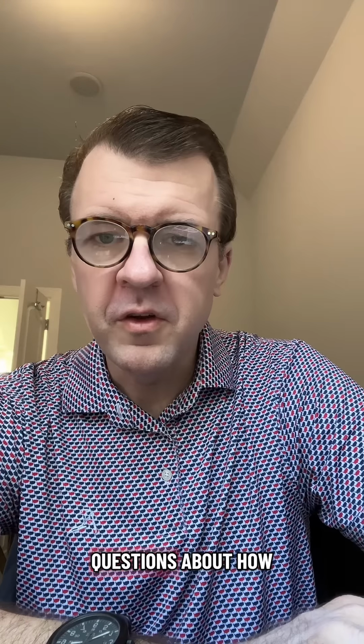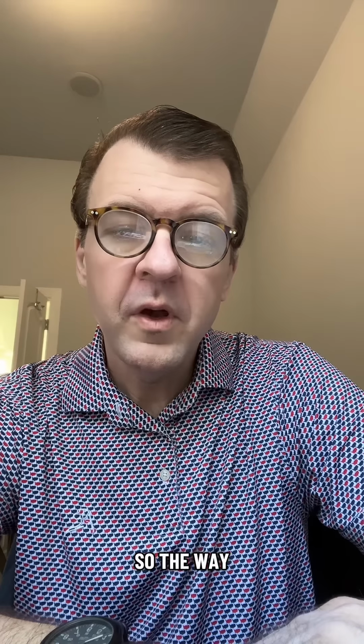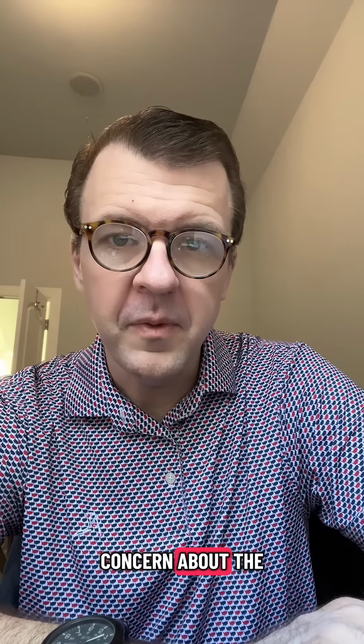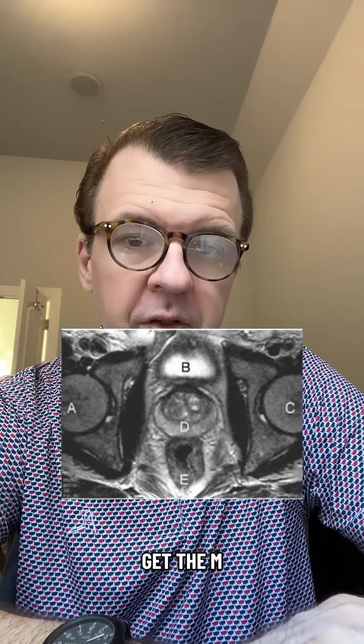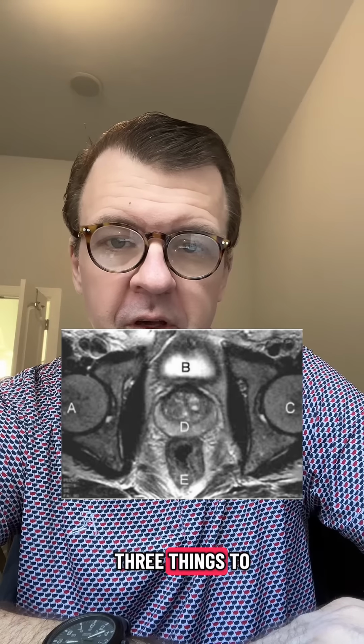So I get a lot of questions about how urologists make use of MRI for prostate cancer screening. The way it works is we get an elevated PSA, the blood test that screens for prostate cancer, which raises some concern about the possibility of prostate cancer being present. Then when we get the MRI, there are essentially three things to consider.